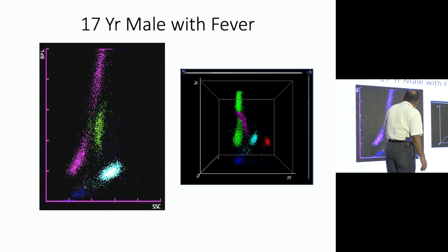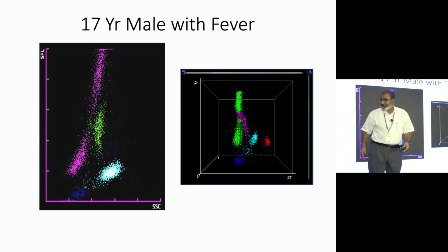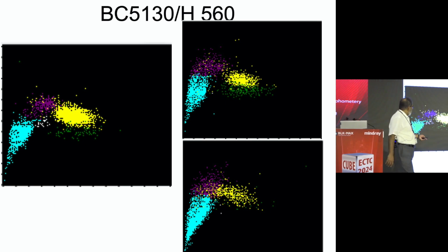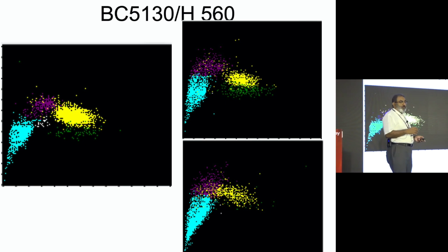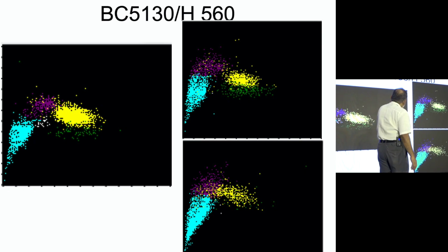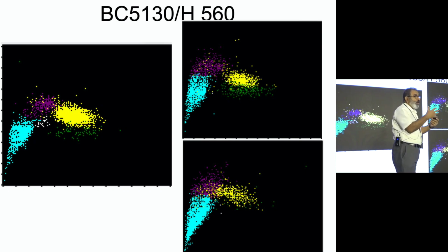And that's the reason why they take this particular direction, because they go along the monocytes. That's why the turn happens. While if you have reactive lymphocytes, it should go this way. So this is a very classical pattern that you see in dengue. And when you want to see dengue in other cell counters, you look for lymphocyte monocyte overlap.